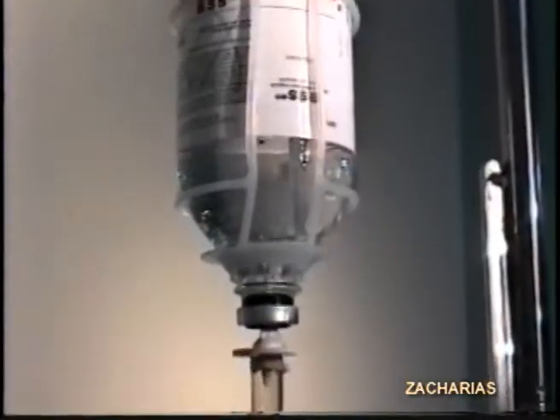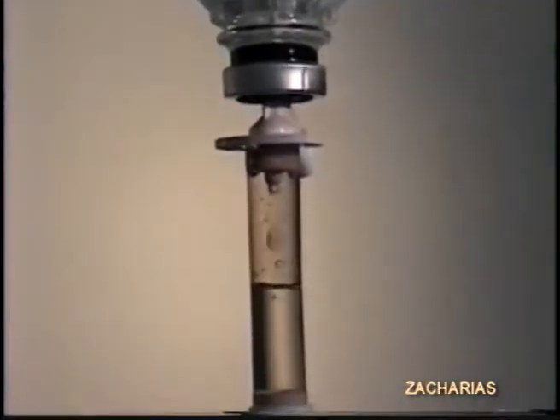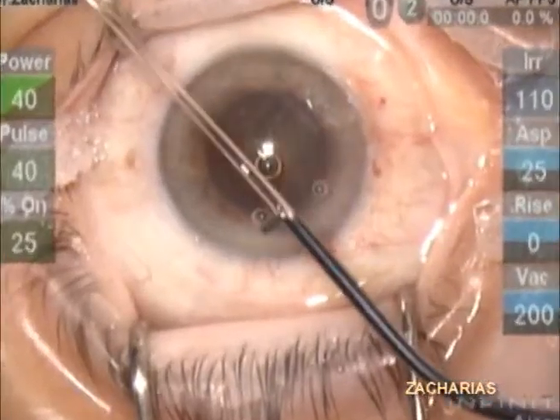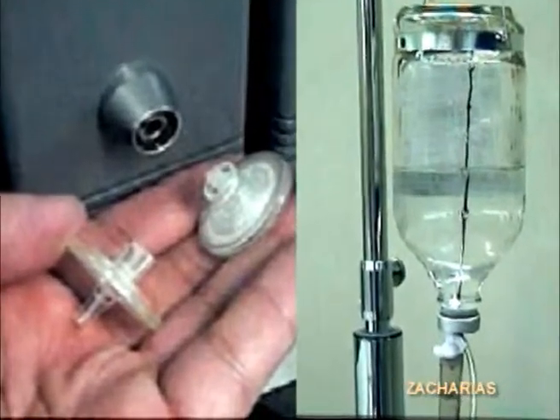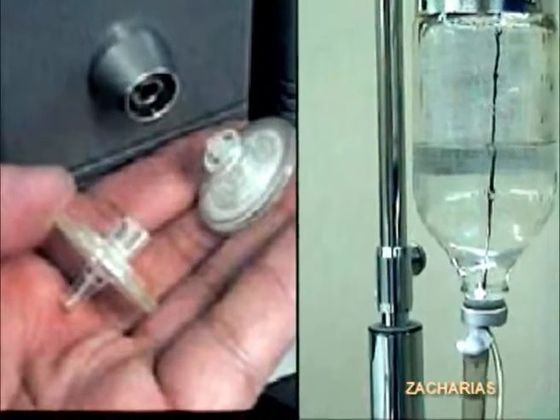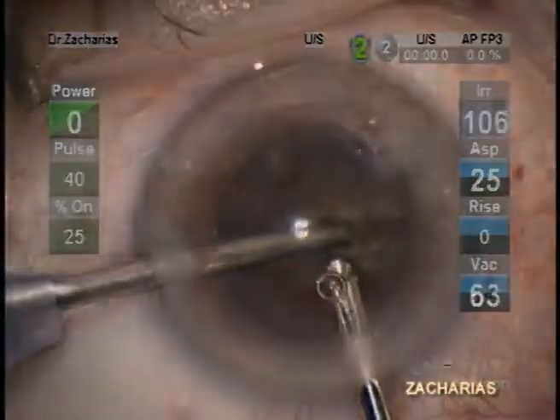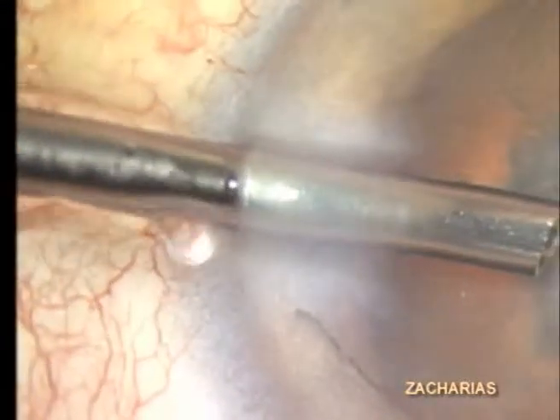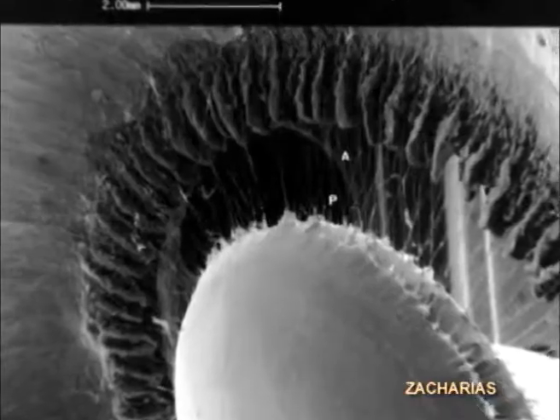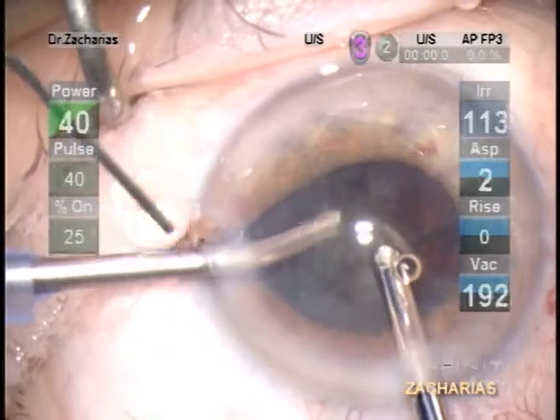The typical gravity-fed infusion system used for classic phacoemulsification has proved insufficient to provide adequate inflow to the irrigating instruments used for MICS. One solution has been to pressurize the irrigation line fluid using compressed air applied internally or externally. Although this solution may improve inflow and protect from chamber collapse, big IOP fluctuations are observed related to the amount of fluid exiting the eye during the operation. Pupil contraction, zonular problems, and optic nerve damage are some of the potential risks of these extreme IOP fluctuations.